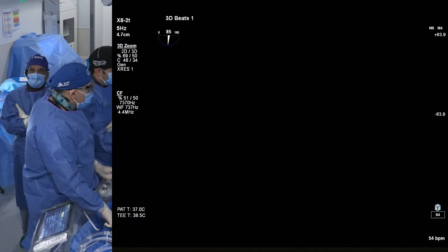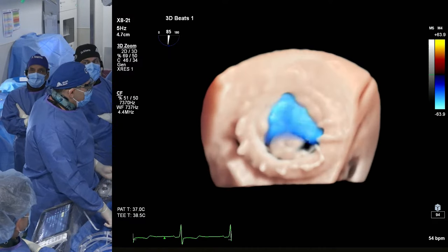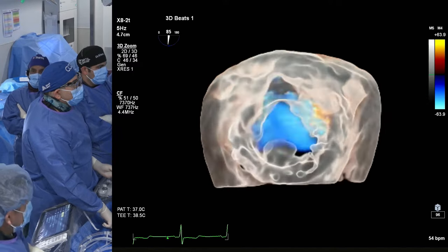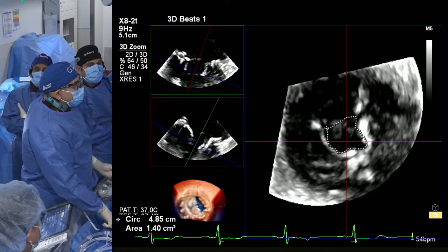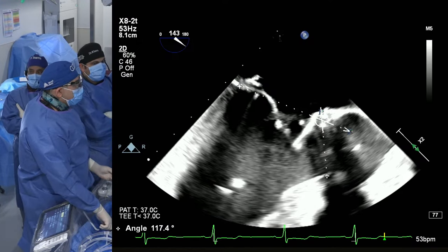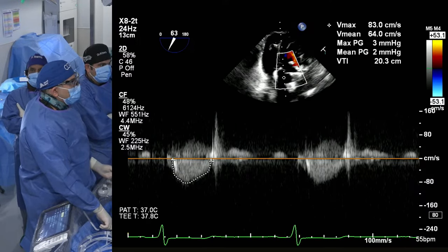This is a true view image. The same, the posterior leaflet of the prosthesis doesn't move. Not much mitral regurgitation, mostly degenerative mitral stenosis in this case. Again, no MR. The area that we get today is 1.4, consistent with severe mitral stenosis. The aortomitral angle for neo-LVOT obstruction is 120, which is wide, so the risk of neo-LVOT obstruction is low with this angle. The baseline peak gradient through the LVOT is 3. Thank you very much.